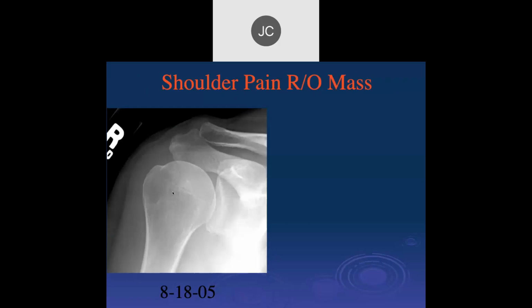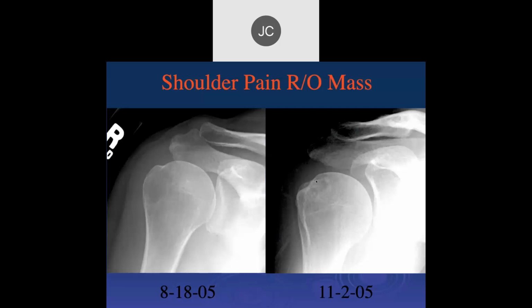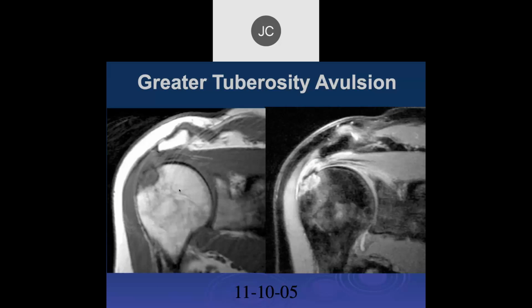I remember many years ago, there's a famous musculoskeletal radiologist by the name of Murray Dalinka, and he was shown a case like this as an unknown at the RSNA. There was a big debate over this. That particular case, they ended up saying was normal. But in this particular case, we see that it actually progressed. This is often a lucent area, but the fact that there's pain makes that lucency a little more important, and probably tenderness too. Yep.